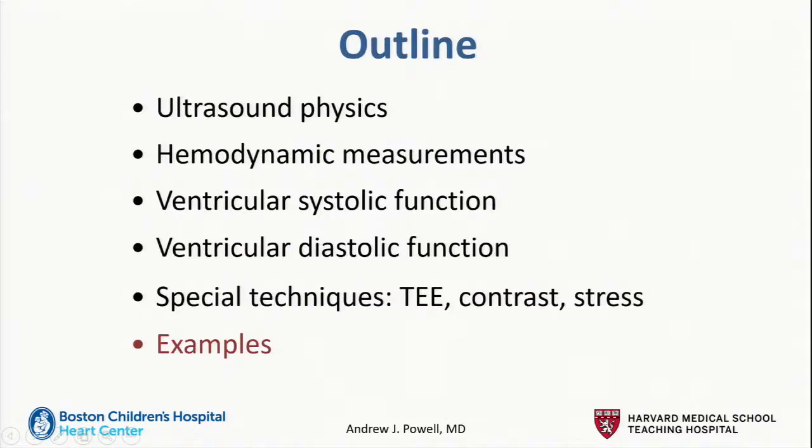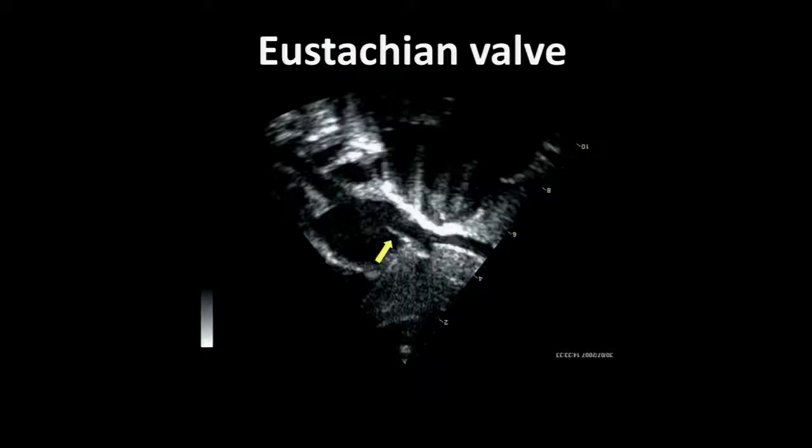All right. For the remaining time, I'm going to go through some examples of echo with a little bit of commentary. You can kind of think of this as echo flashcards just to provoke your thinking and remind you of a few things. So one of the things the board likes to do is make sure you know normal. So we'll start out with this.